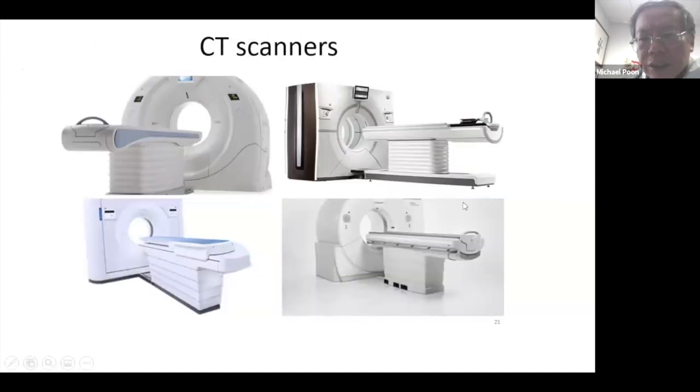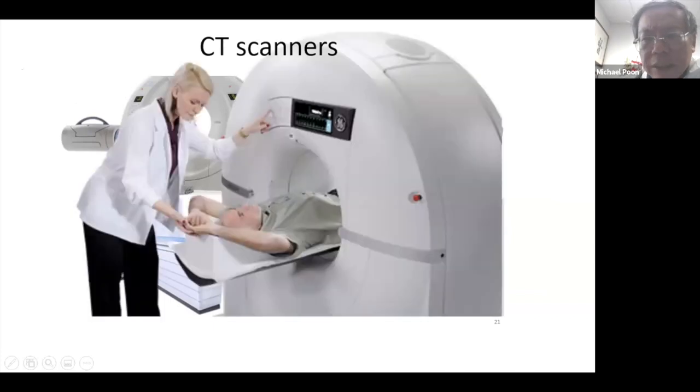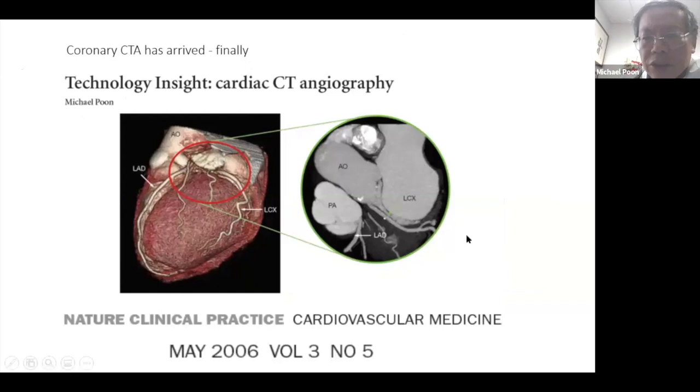And now using the CAT scanner, the same one that I showed you earlier, we are able to see and detect early disease in the blood vessel. This is work I did almost 14 years ago. Using the CAT scan technology, we start to look for early plaque occurring in the blood vessel. So this is the stage where you can do something, either by changing your diet, increasing your exercise, or starting to take medication, if you cannot change your diet or exercise enough to decrease the cholesterol level and sugar level in your body. But you need some way of looking inside to see if you are at risk of developing heart problems.